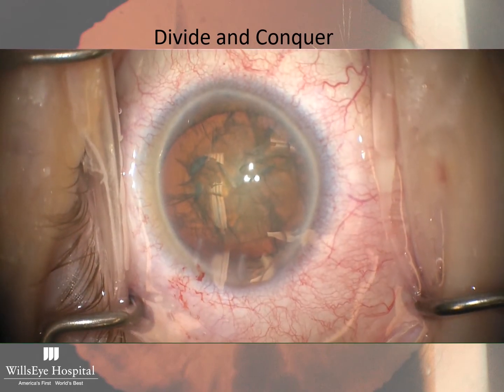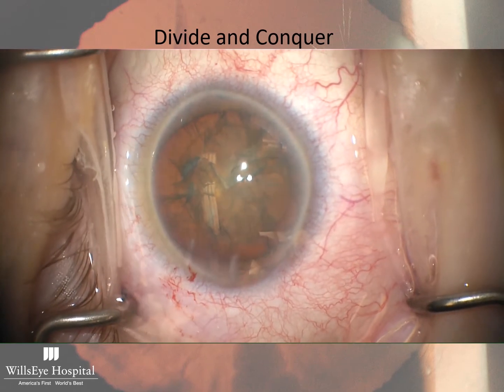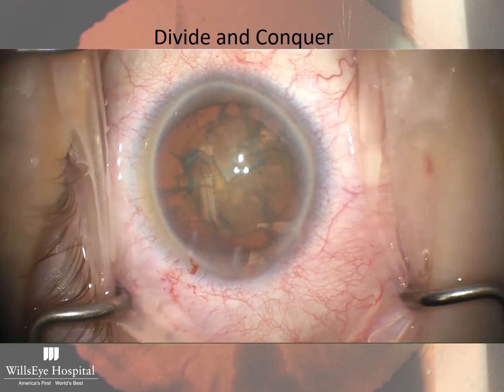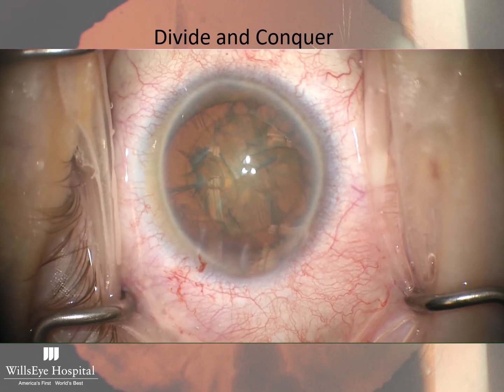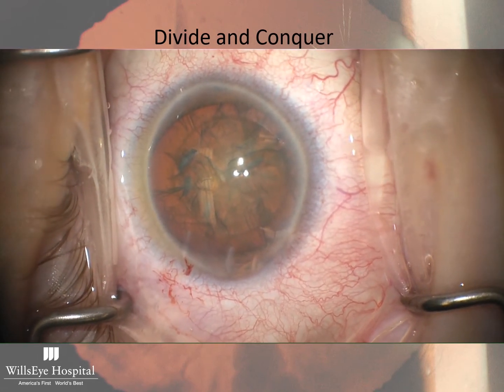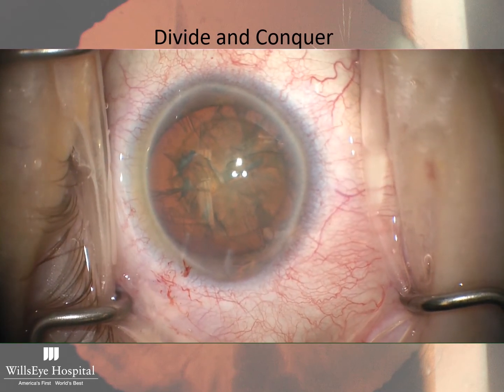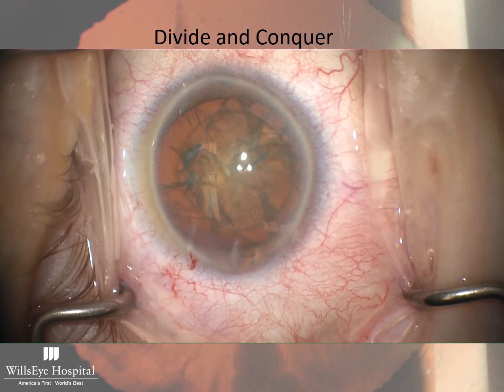If you're having difficulty with hydrodissection, I recommend using a Chang cannula, as you can hydrodissect subincisionally, and it's also easy to rotate the lens using the cannula almost like a pick. So at this point in time, we're going to go ahead and start with the phacoemulsification.